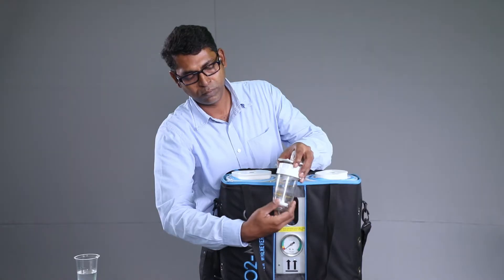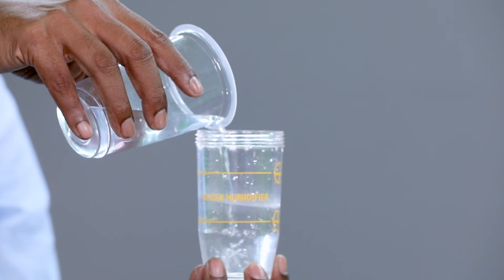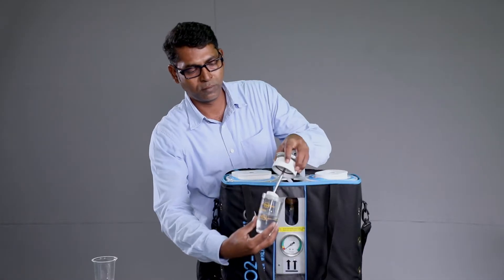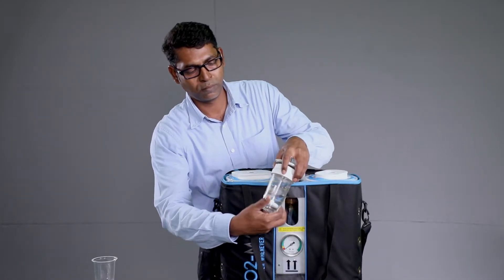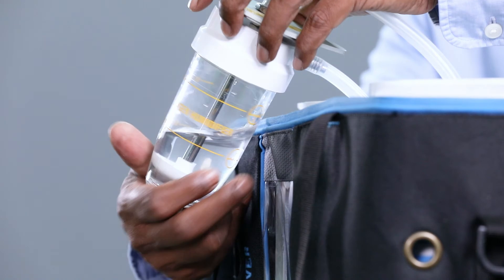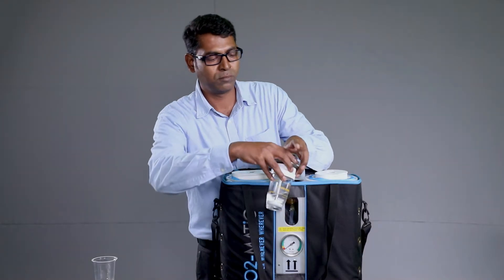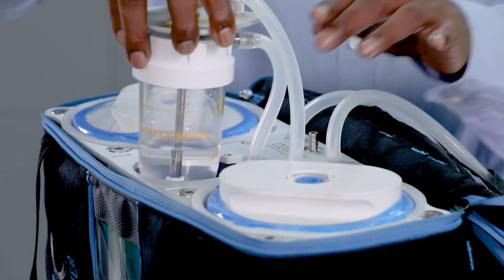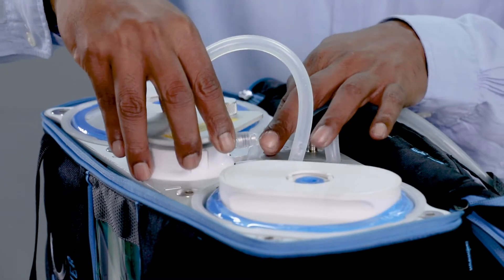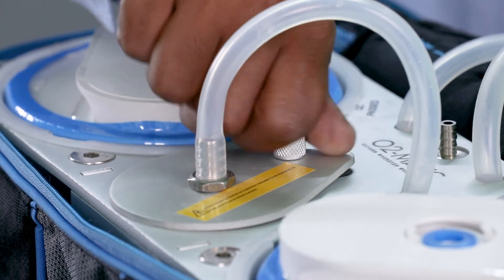Unscrew the humidifier. Fill drinking water to the minimum mark in the humidifier. Screw the humidifier filled with water back carefully. Warning! Tighten it adequately to avoid any oxygen leakages from the humidifier. Position and put the humidifier back into the main kit and fasten the humidifier cover knob to secure the humidifier assembly in the main kit.